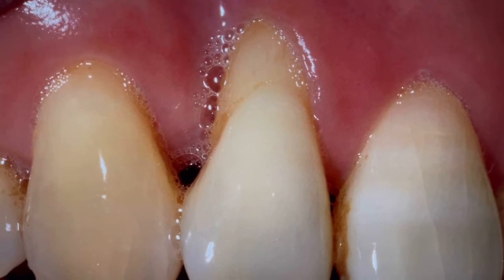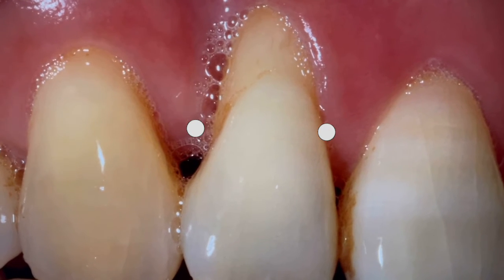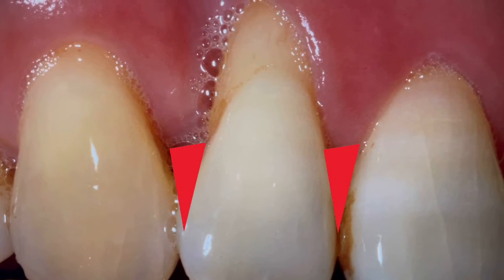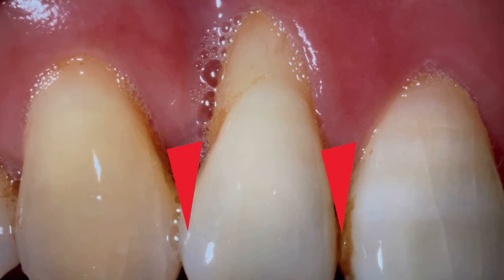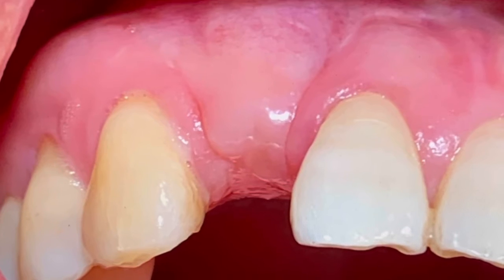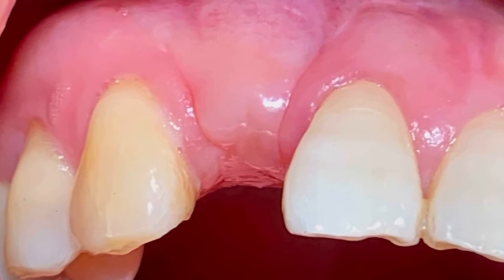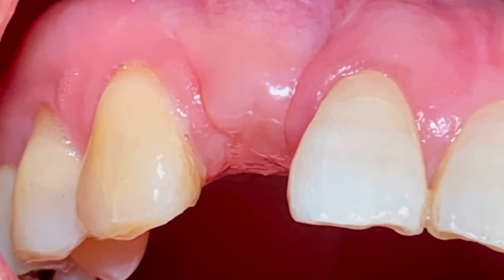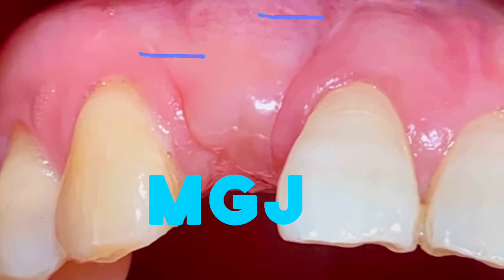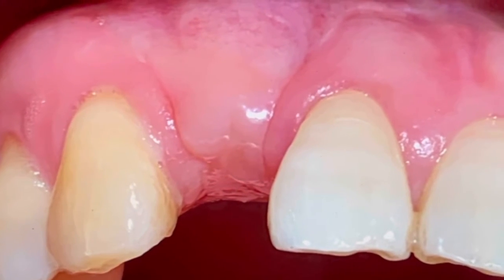The way that was done was using a papilla sparing incision, given she had a relatively high smile line, and we didn't want to increase the amount of recession that's already occurred interproximally. We can see post-operatively from the graft, you see that papilla sparing incision and the scarring that's occurred mesodistally. That of course flattened out over time, but we have advanced the flap, and you can see there's a difference in the mucogingival junction, which will be addressed by removing that back at the time of second stage surgery.